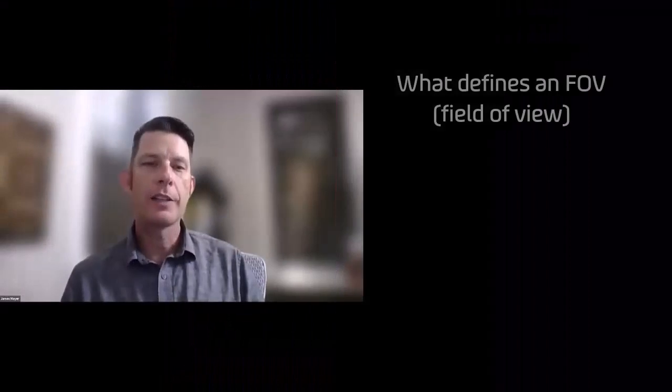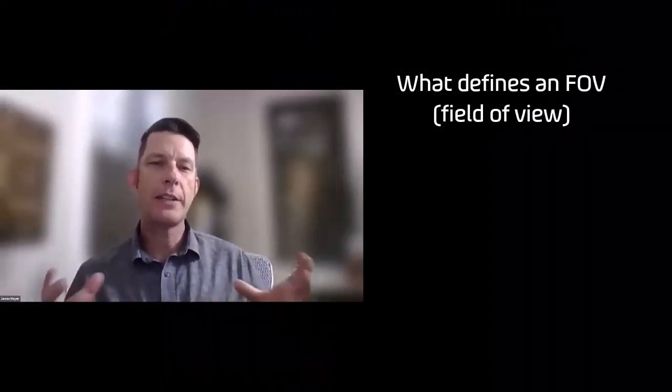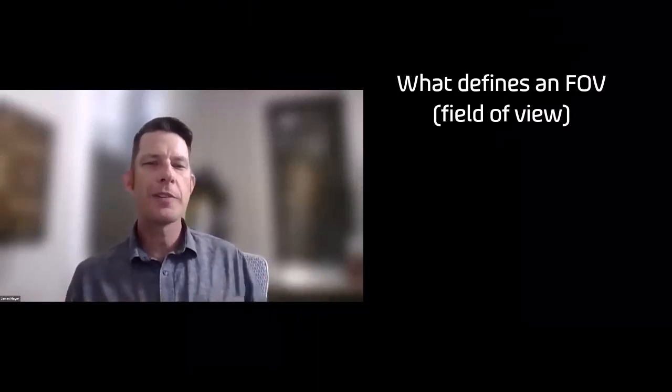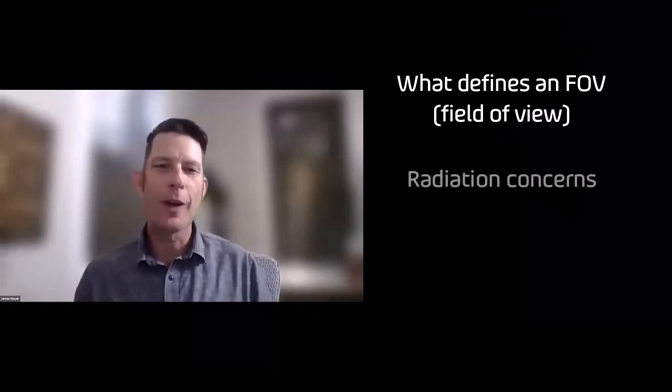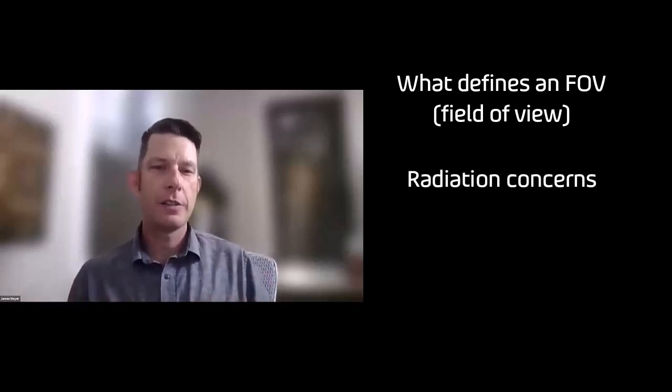Diving into some of the bullet points that everybody can expect today is, what defines an FOV, or a field of view? Let's look at some clinical applications of what we can capture within each of those fields of view. We're going to provide some examples. There's always that concern of radiation dose, right? Of what is the dose? Patient care, right? Patients want to know. But I think you're going to talk a little bit about that and how do we address those concerns.